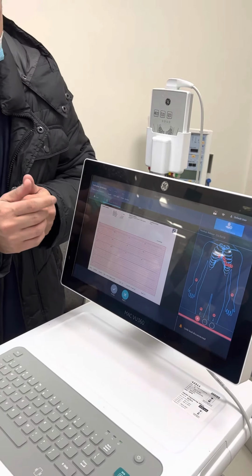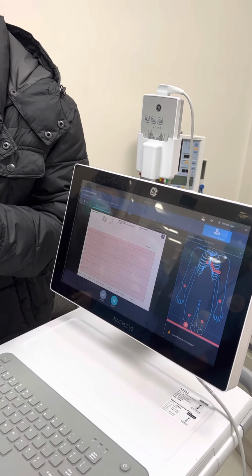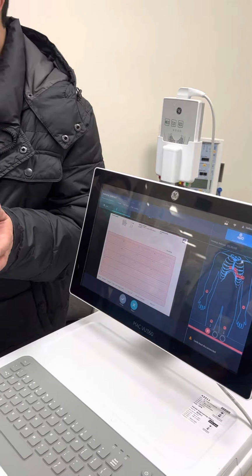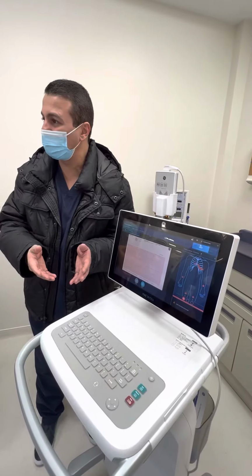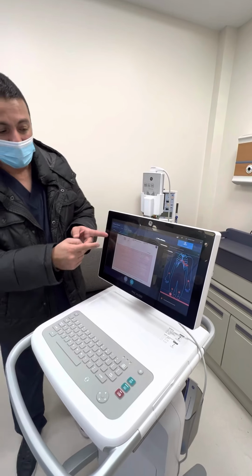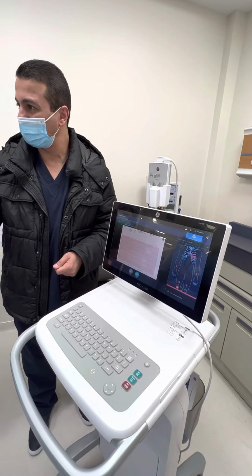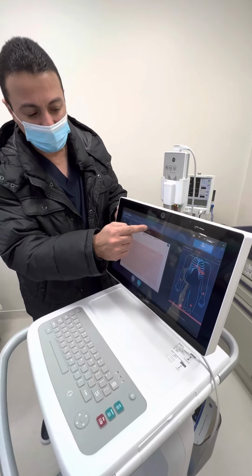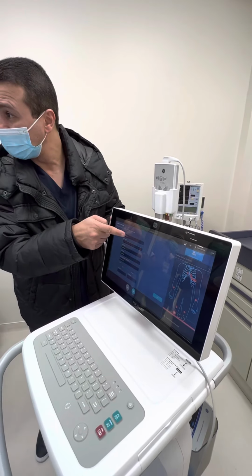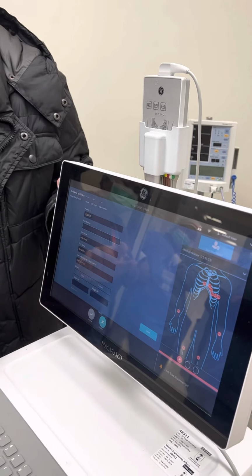The other thing, if there is no time to enter your patient demographics, later on you can enter it, right? But now you want to do the right management for your patient. You want to deliver that report to your physician. So what will you do? You will acquire your ECG. You show it to your physician. You can do the adjustment by pressing the arrow on the top here. You can adjust the patient demographics here, but still there is no order.